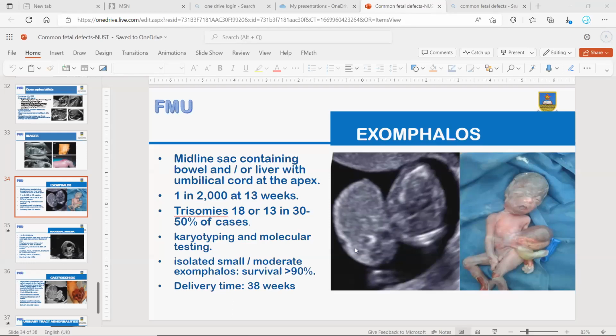that has allowed the organs of the abdomen to herniate outside their normal location. And what you are looking at here is the liver. That's the baby's liver. There is the liver. And of course, probably some bowels, and sometimes we may have stomach in it. This is what you are seeing being represented here, right?